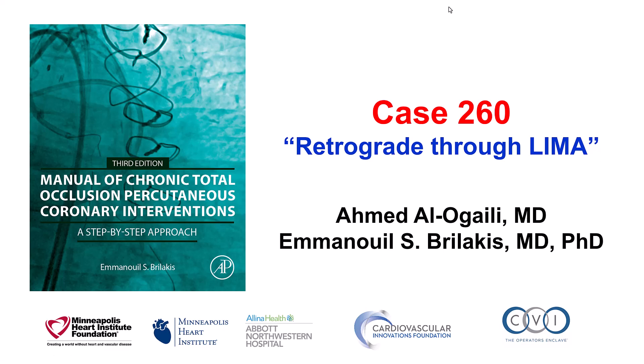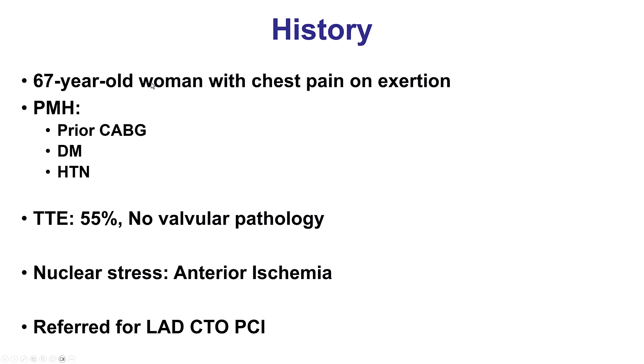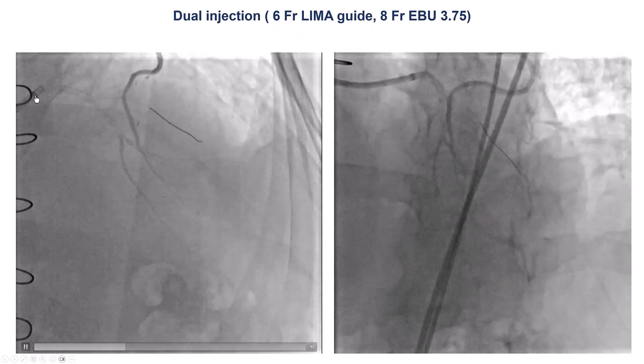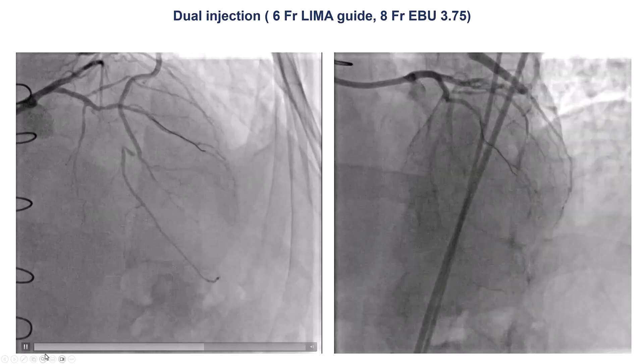This is Ahmed Alokaili and Manos Brilakis presenting case 260 for the Manual of CTO Interventions. This is a relatively rare case in which retrograde crossing was done through a left internal mammary artery graft. The patient was a woman with previous coronary bypass graft surgery, presented with exertional angina, normal ejection fraction, and had anterior ischemia on the stress test. The coronary angiogram shows heavy calcification in the LAD.